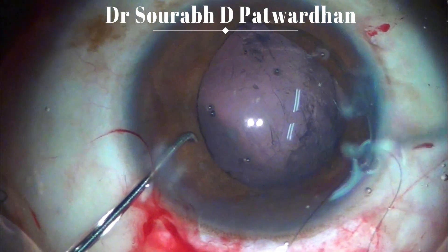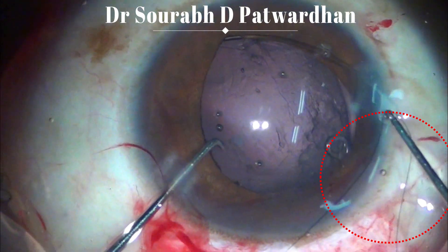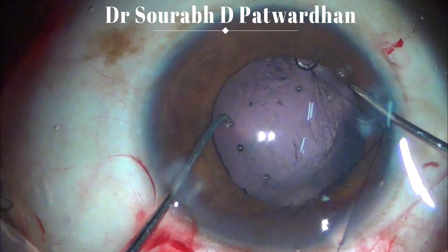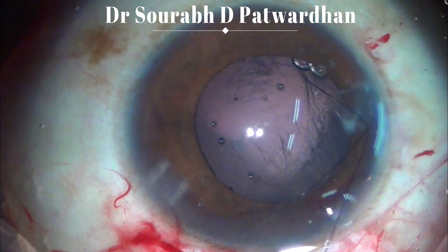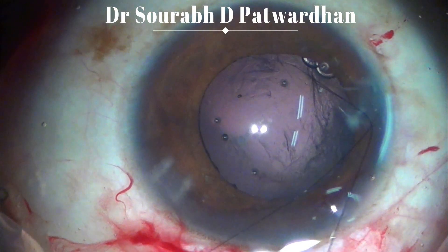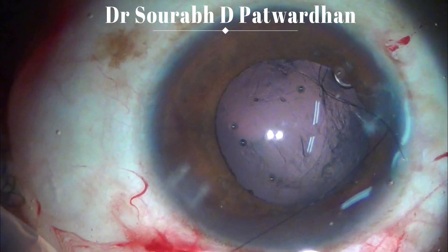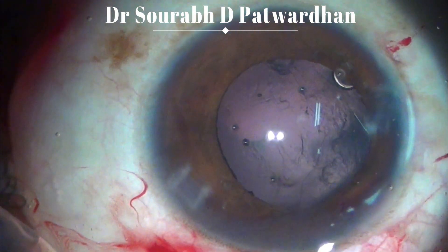So what I have done here is thread one of the eyelets using a 10-0 nylon suture. Now under careful visualization I am inserting the CTR. You can see that the CTR has gone properly inside the bag and that area from where I had cut the capsulorhexis was not torn. Now I know that the CTR is supporting the bag well and I can release and take out this suture. This suture really helps in case there is a posterior capsular rupture or opening during CTR insertion — you can always pull this CTR end out and take out the CTR.